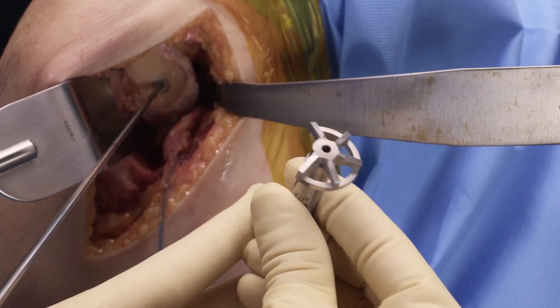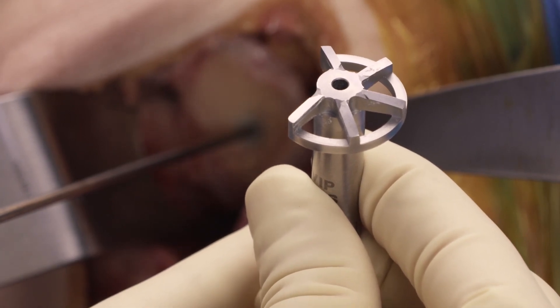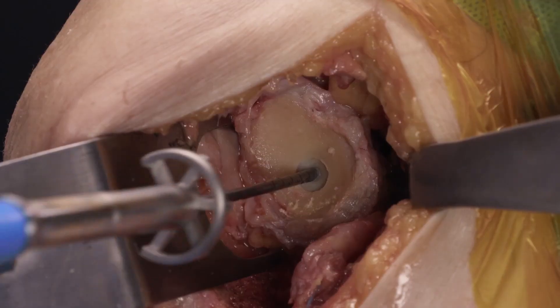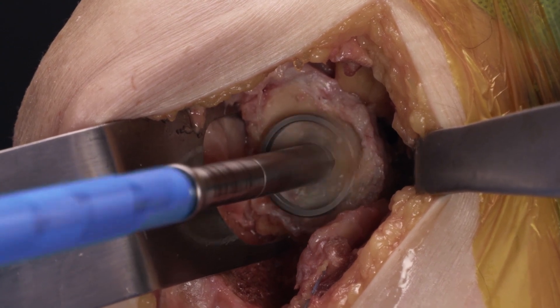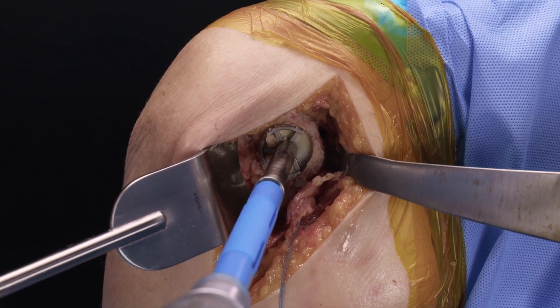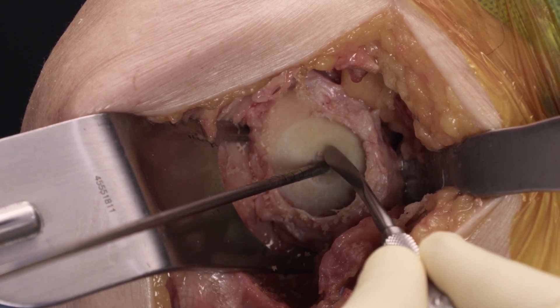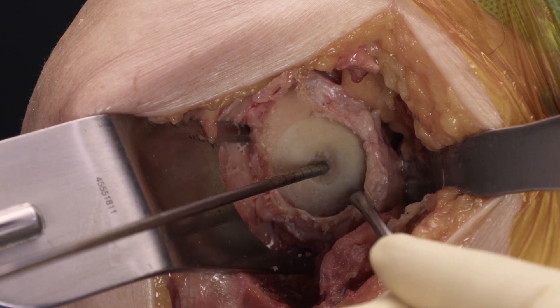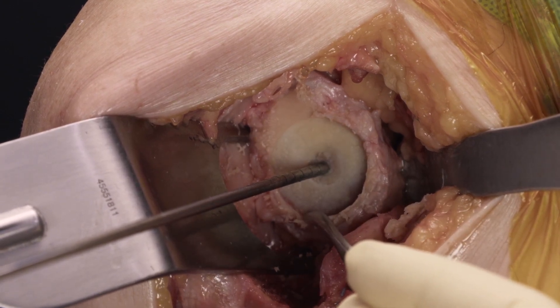Next we will use our secondary MGS VIP reamer. You'll note the key difference between this VIP secondary reamer and the standard MGS reamer is the flat smooth hub. We'll use our secondary VIP reamer and this will ream until there's a positive stop. Now our reaming is complete. You can see that the pilot ream no longer shows, so we can be very confident that we've matched the depth of reaming from our VIP plan to get the backside seating we were planning for our MGS implant.